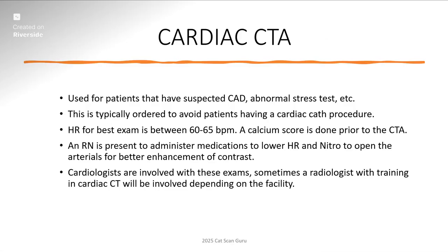A calcium score is usually done prior to the CTA. So they do the calcium score to measure, and they use the Agatston score to measure how much calcium is present in the patient's cardiac vessels, which I have an entire course on cardiac CTA that dives into. So I'm just giving you a general perspective.